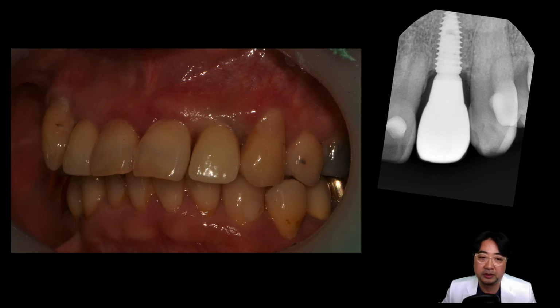I'm very careful about the link abutment, and if a patient came again like this with the link abutment, I think I'll do the same thing. I'll make a model, cement it on the model, and deliver it in the next visit.